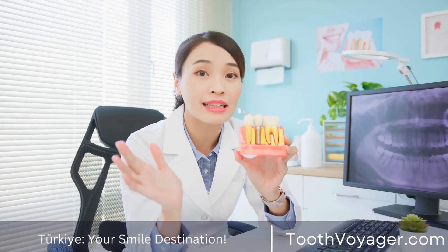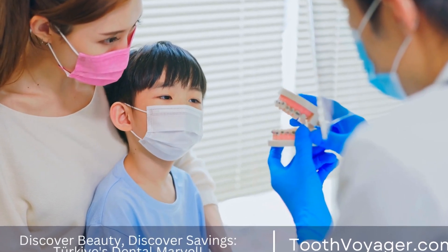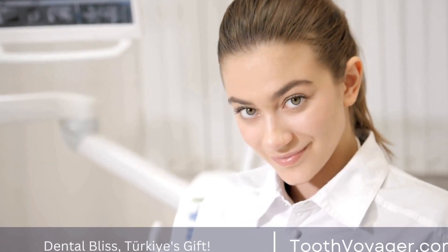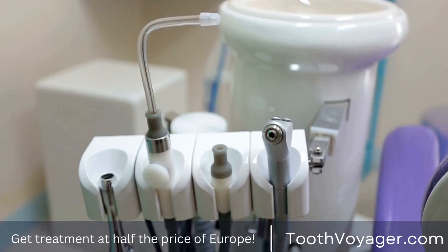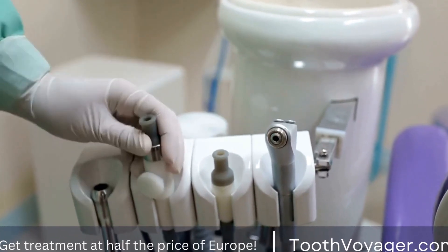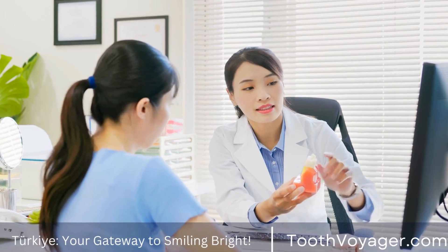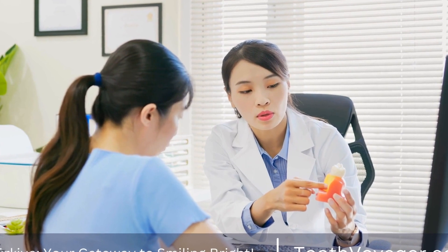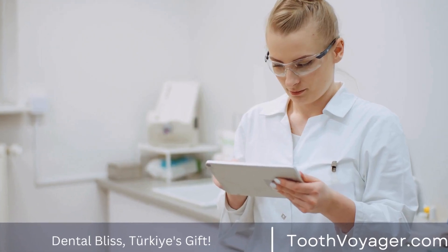What are dental implants? Let's start with a brief overview. Dental implants are titanium posts that are surgically placed into the jawbone to serve as an artificial root for a replacement tooth. These posts are then topped with a crown that looks and functions just like a natural tooth. Dental implants are known for their durability and longevity, making them a popular choice for patients looking for a permanent solution to missing teeth.